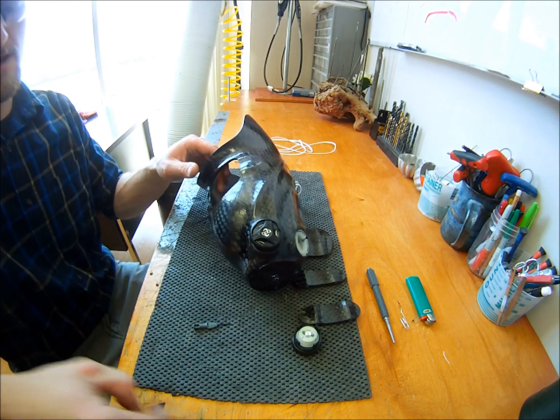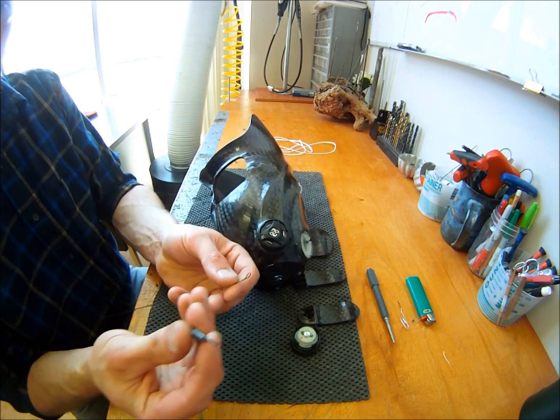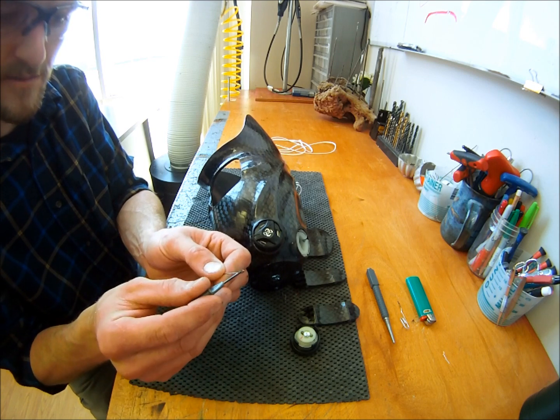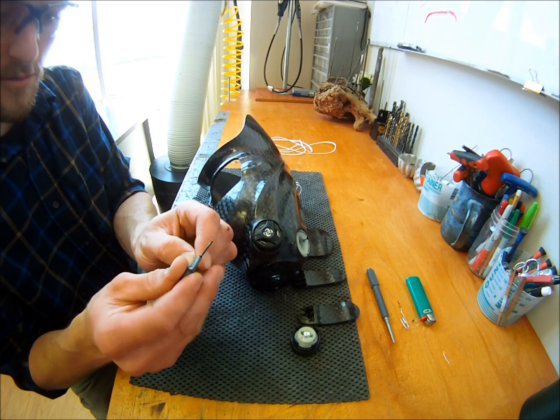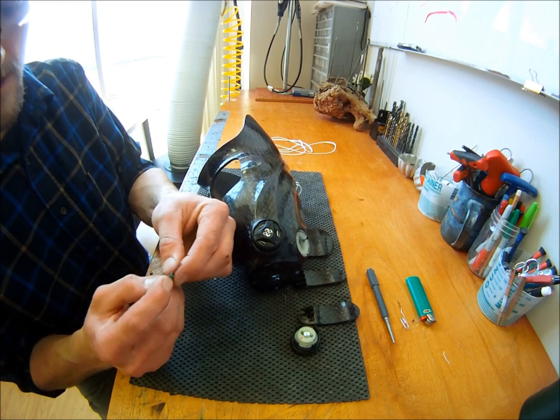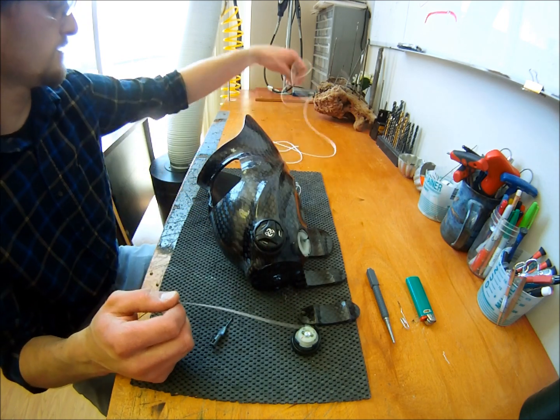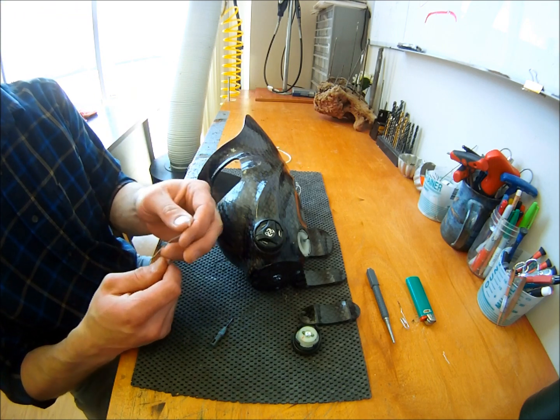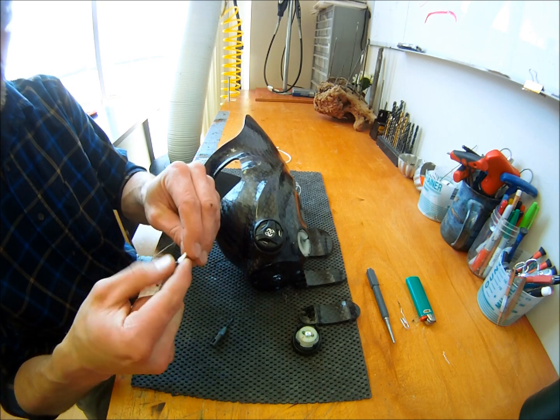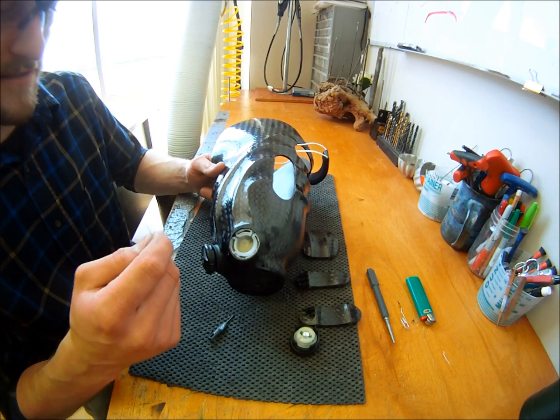To lace the socket back up, you have your wire feeder and your T6 tool. Sometimes the opening on the wire feeder is closed and you can't insert the spectra. It's helpful to use the little tool to open it up, slide it onto the shoulder of the tool, and create a wider eye in the feeder. At that point you can insert your spectra, leaving a small tail, and then begin lacing at the dial.